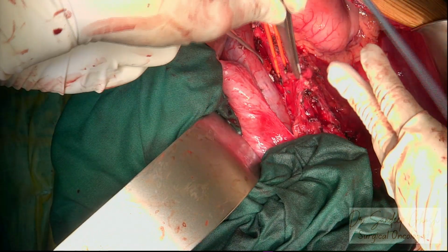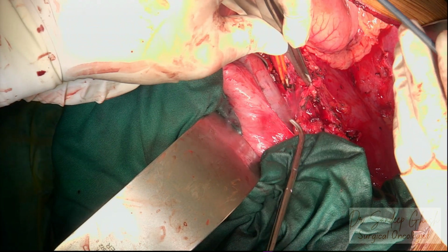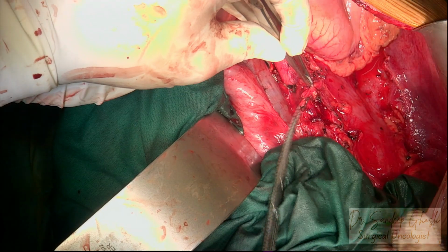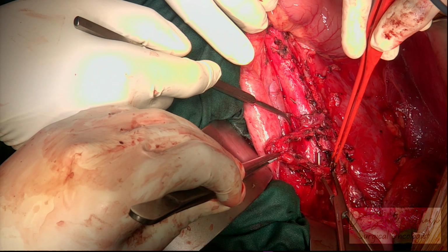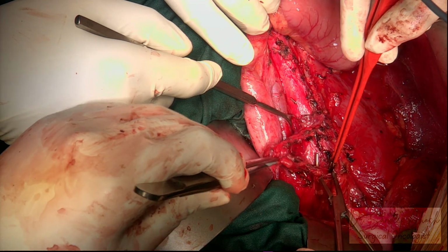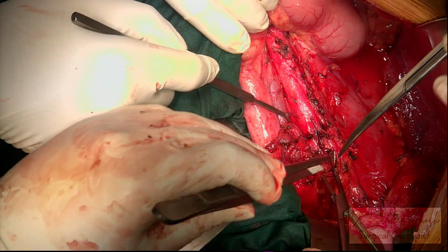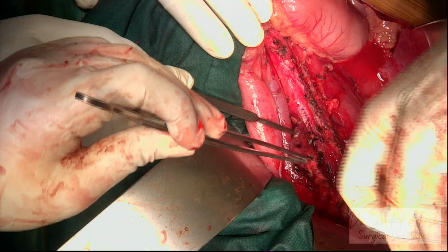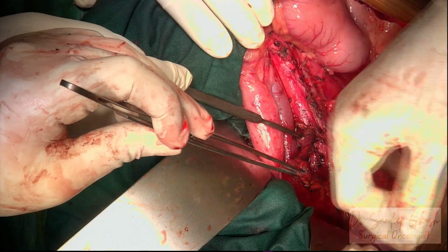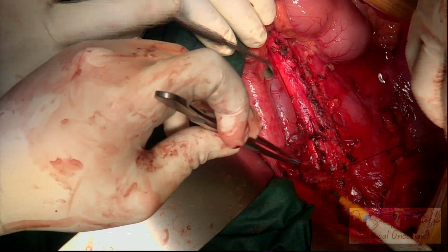As you can see, we're moving in the caudal direction. The lumbar vein or artery being encountered is being taken care of. We're separating it from the IMA on the left side. That's the entire interaortocaval lymph node packet. Now we are ligating the inferior most part of that packet before removing it.